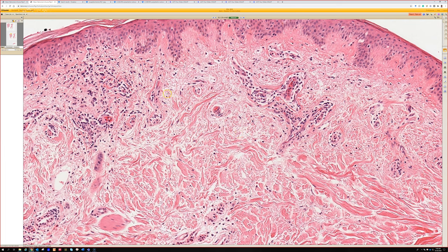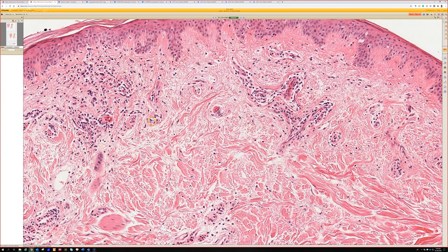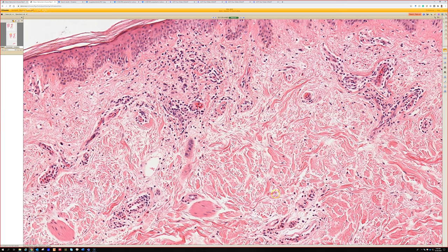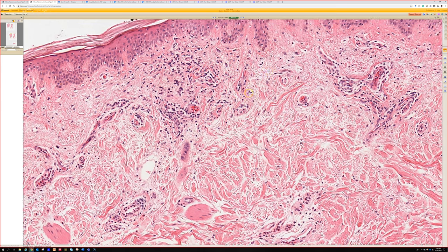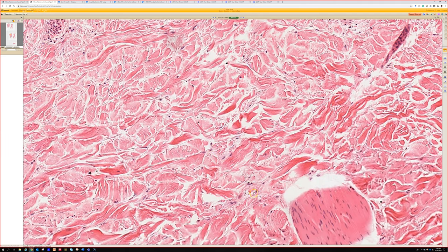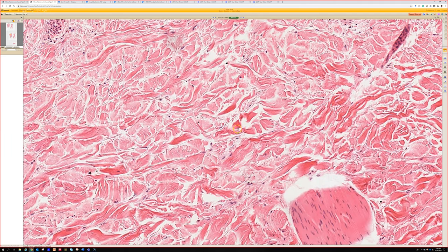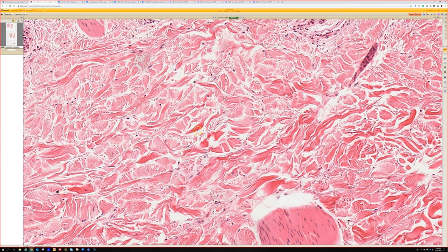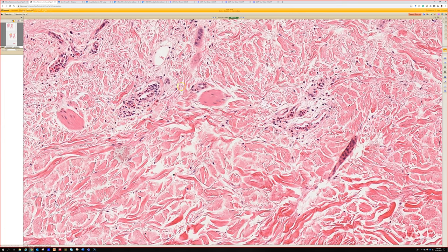Is there a little extra pale space in between the collagen bundles? You can always hallucinate it if you want to, but I think this is legit — this is really edema here, extra fluid pushing the collagen apart. Edema is a little bit in the eye of the beholder, especially down in the reticular dermis. In the papillary dermis, it's a little easier to see that edema is real — the pale fine collagen usually goes with real edema.